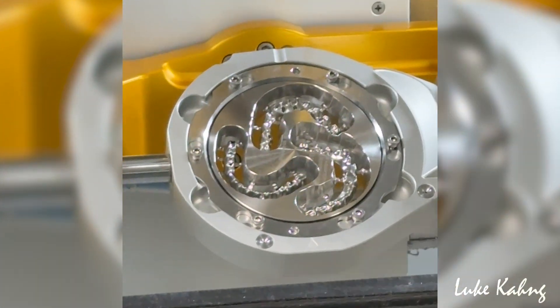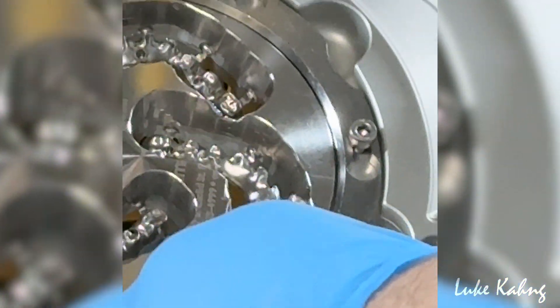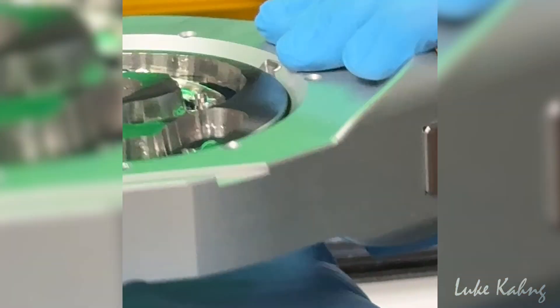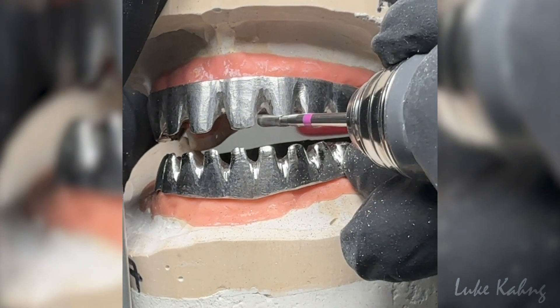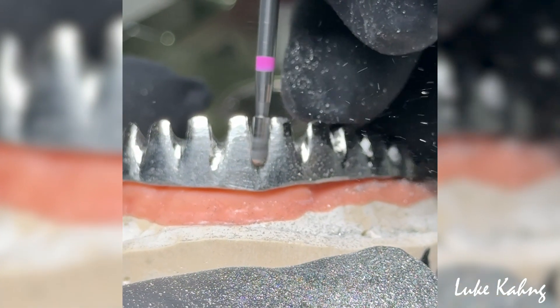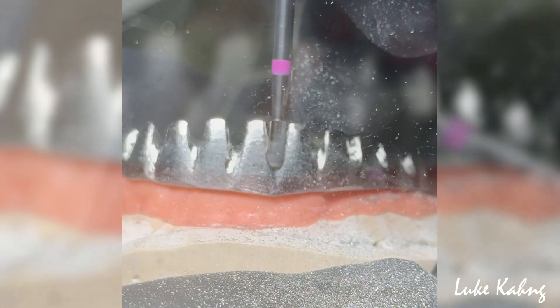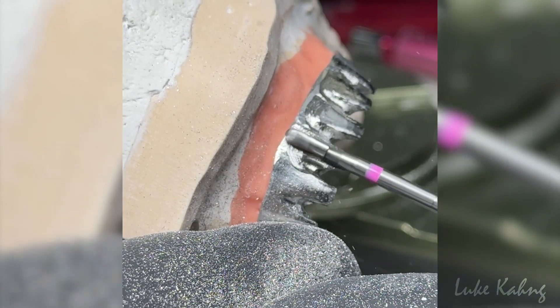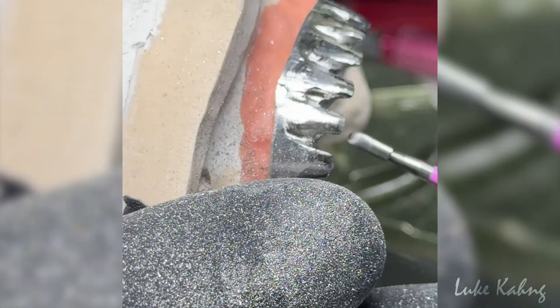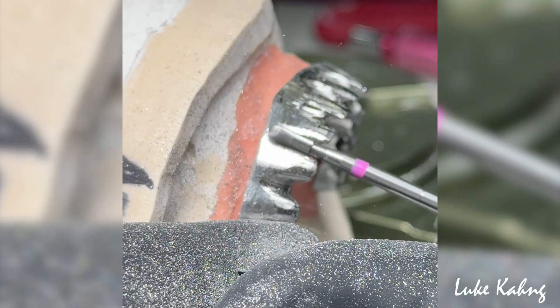The frame design from the milling machine is very important. It's very difficult — it depends on the case. Usually milling strategies help, but sometimes we have to re-mill again. Finally we got the frame design from Imaging iMilling, which is a great machine. After that, I grind in quite a bit of detail which the technician did not know. I know the facial contour because I don't want opacity — I want the prettiest possible result. There's more detail about interproximal and especially underneath — it's very difficult trying to cover the implant site but not show it, trying to bring the restoration as close in as possible so we can create more lifelike restorations.